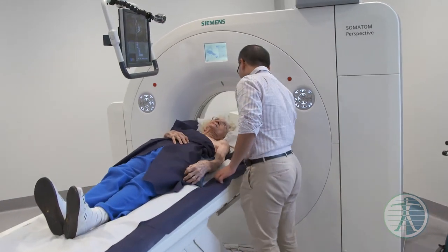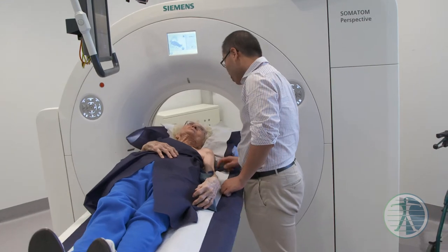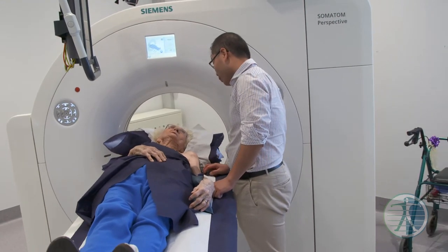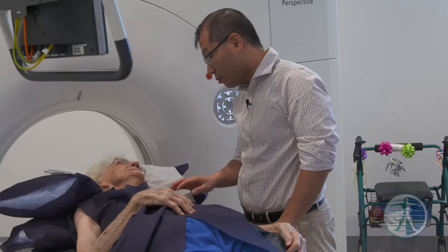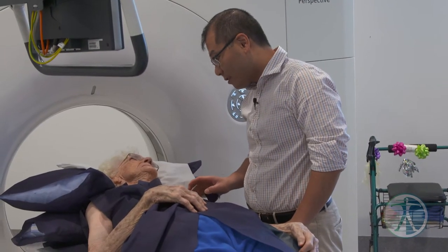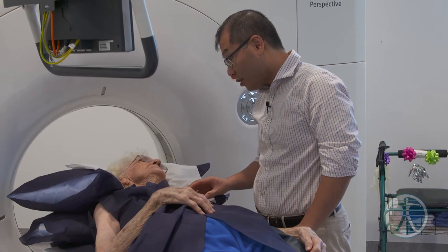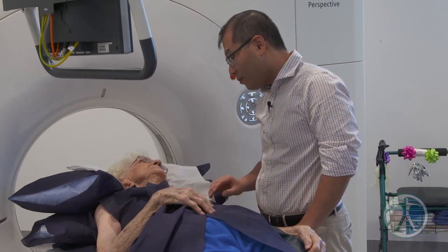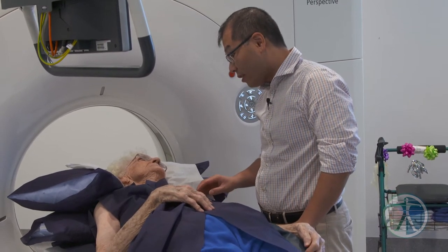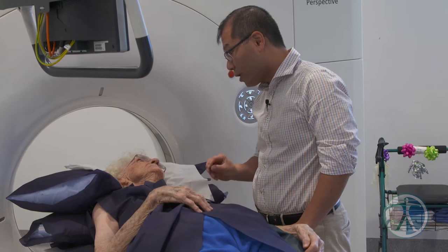Hello Joy, I'm Paul. I'm going to do this injection for you today. I'm going to sterilize the skin, give you anesthetics to the skin, and then use a needle to get all this fluid out.